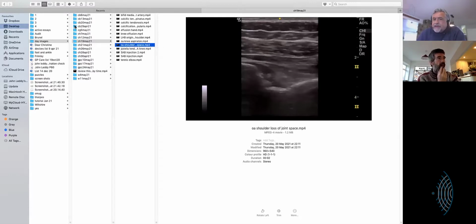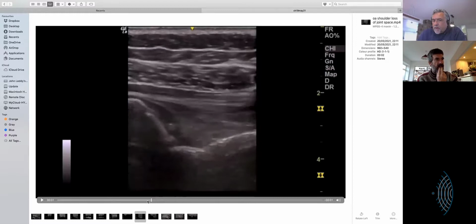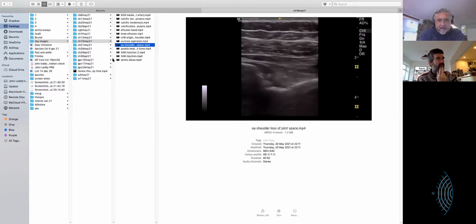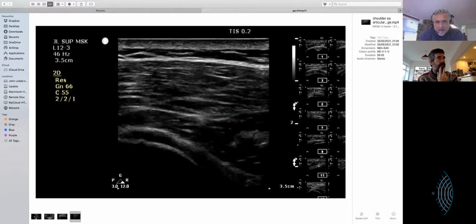And is that darker area capsular fluid on the posterior window one? Yeah, right there. Is that capsular fluid there? Probably, yes. And just debris from the labrum, or well degenerated labrum, those little white things that are around that? I would guess so. Yeah. It could be just about anything under the circumstances. OA cartilage. Yeah. Right.